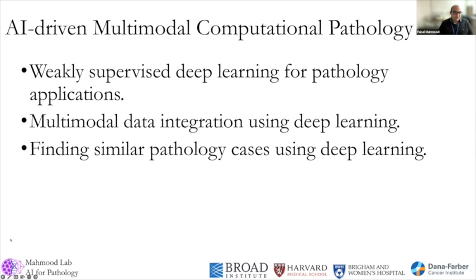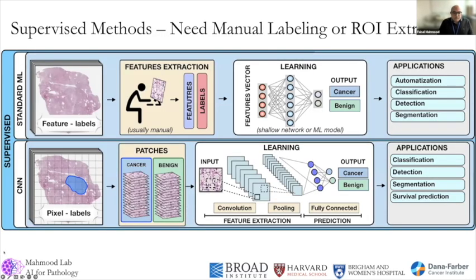So to give a small historical perspective about the field of computational pathology. Computational pathology involves analysis of pathology slides that have been digitized and scanned, and an increasing number of medical centers around the country and elsewhere are increasingly digitizing their pathology slides. So you end up with an image that essentially looks like this, but this image is very large. It can be 100,000 by 100,000 pixels, and it has a wealth of information.